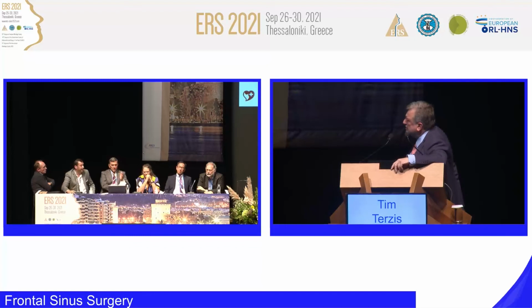Jannis? I will try it conservatively in the beginning, and if the result is not good, then I will open it and see what is the problem, what is the reason for the obstructions. I cannot tell that. I cannot see in the CT now which is the reason for the obstruction. Yeah. I think we have to see maybe a scarring, maybe a circumferential traumatization of the mucosa. You know, actually, we have to see.